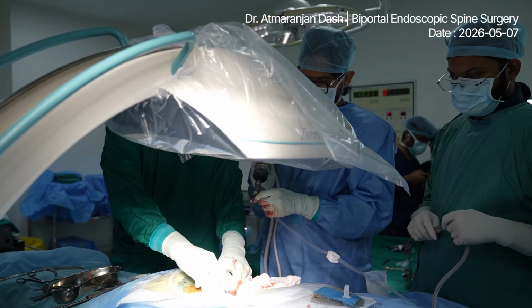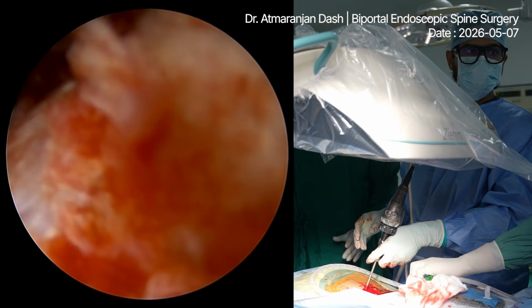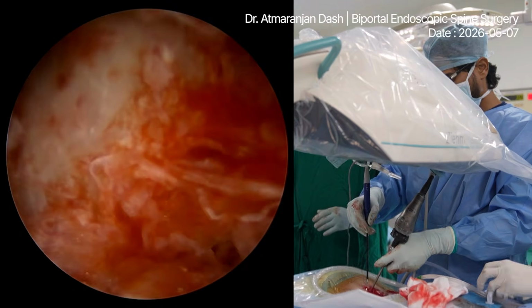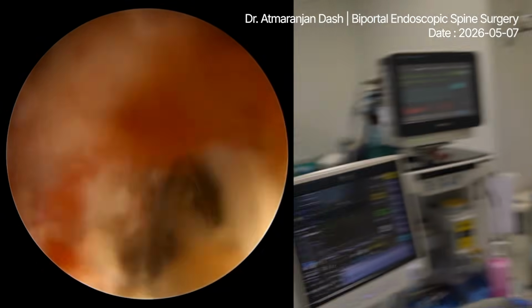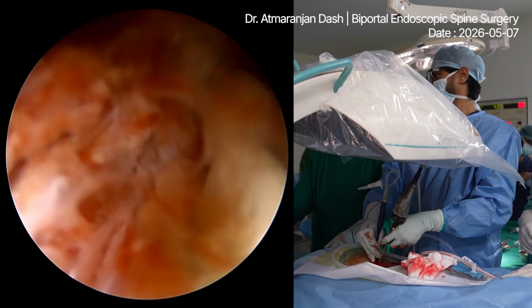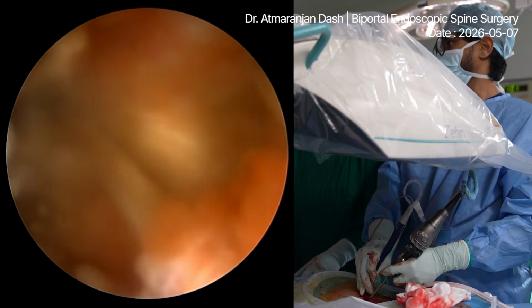Again we will start the para UBE of L5S1 level. Kindly understand, this is a foraminal surgery where the revision cases are done. So you see we have landed on the TP now. Take a picture of there. We have landed on the TP. Here also we have landed on the TP. Coagulation. Saline coagulation.